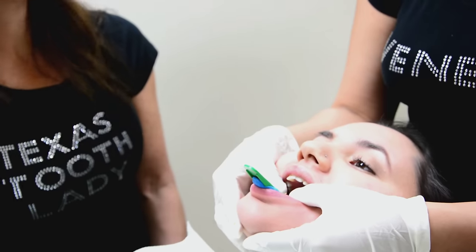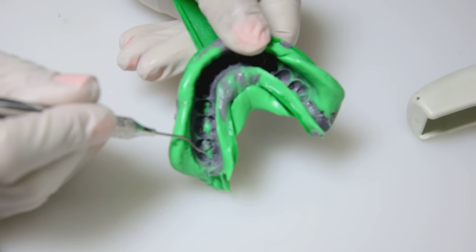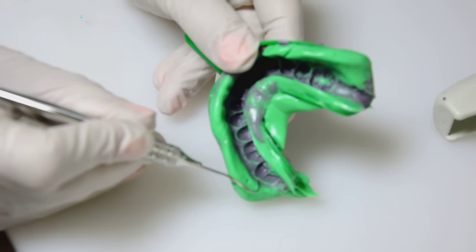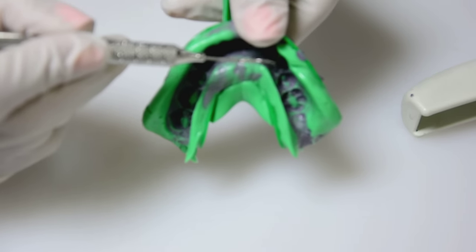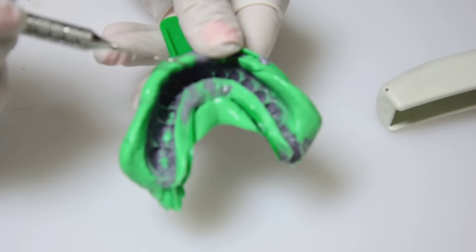It's been about four minutes, so it's ready to be removed. We go ahead and take the impression out. And I want to get a close-up because you can see that it's absolutely perfect — the margins are precise, you see no voids, no holes, and no tears. It's very important that the impression is perfect, just like a crown and bridge or implant impression. There is no room for error.